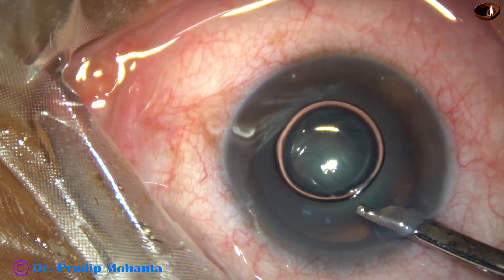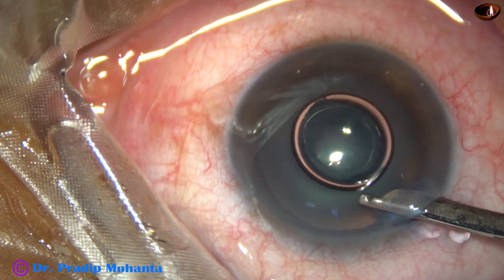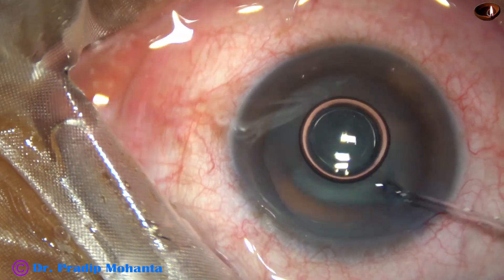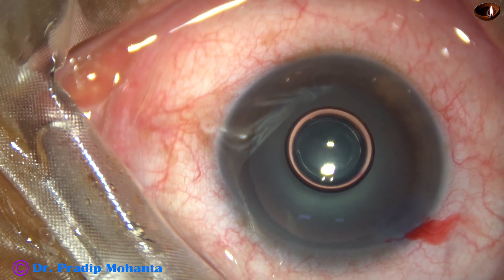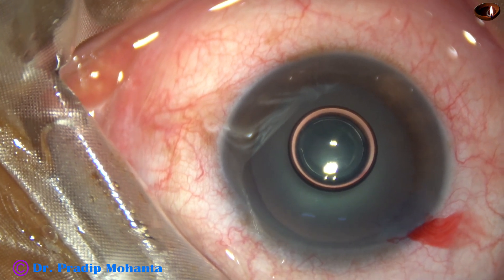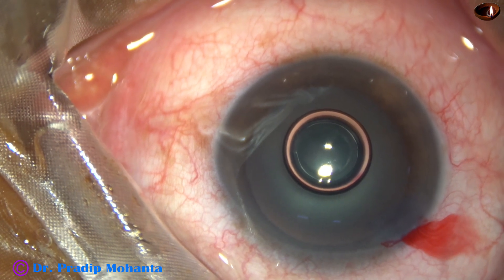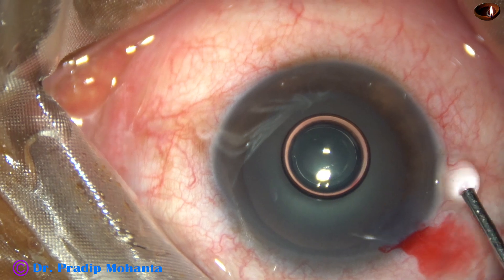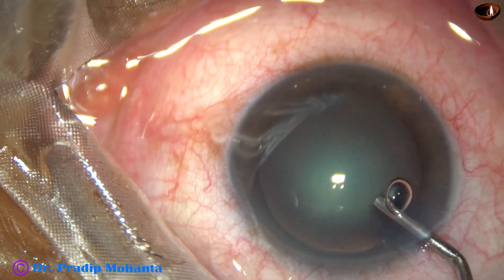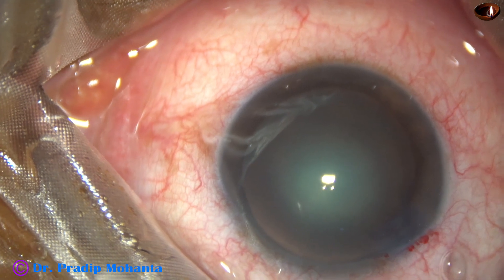Now the dye is washed out with BSS. I'm going to do this surgery slowly to show all the steps clearly to a trainee — to a beginner phaco surgeon.